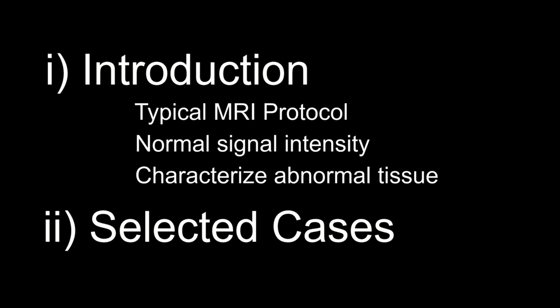For Gyne MRI, the cases will focus on a few key areas: characterizing adnexal masses, staging malignancies, and uterine anomalies. There are also a series of more challenging and interesting cases at the end. By the end of the course, you'll have seen the most important pathologies that you need to know.